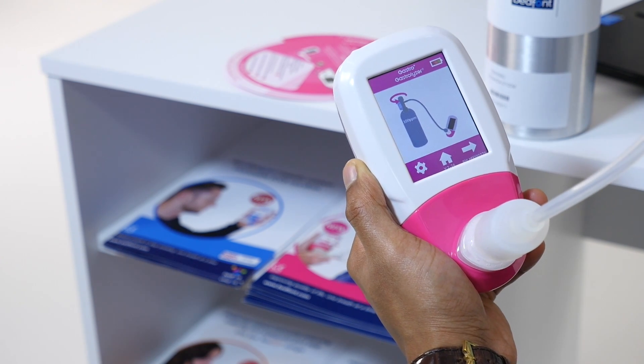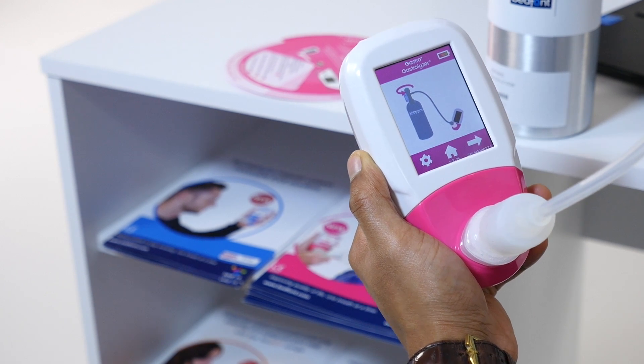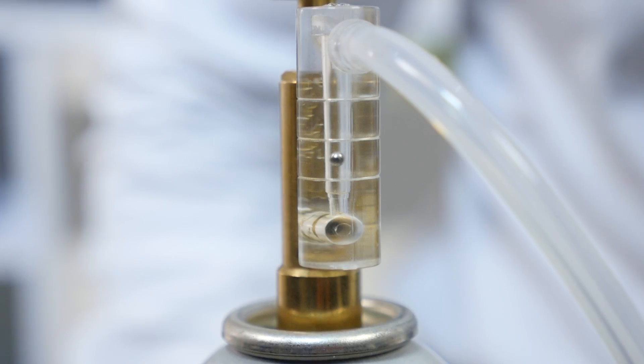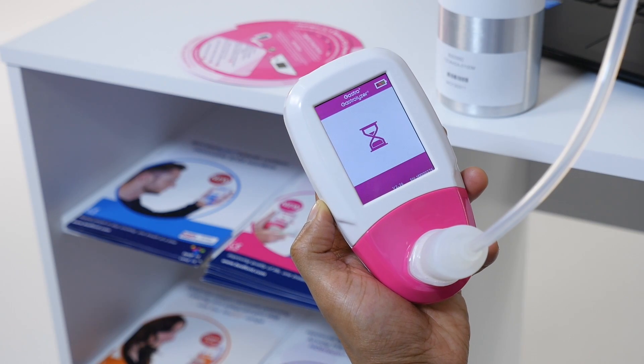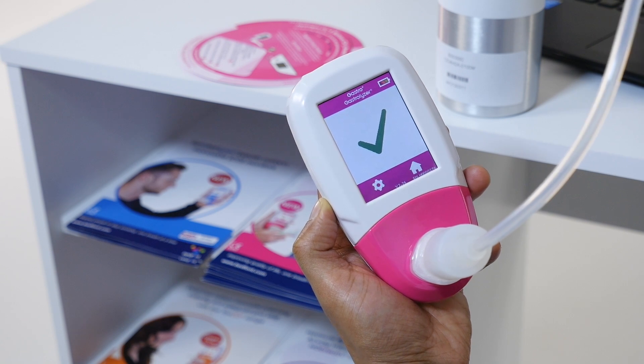Follow the on-screen instructions to finish the calibration process. Gas flow should be set to 0.5 liters per minute. If calibration has been successful, a green tick will appear on screen. You can now return to the home screen.